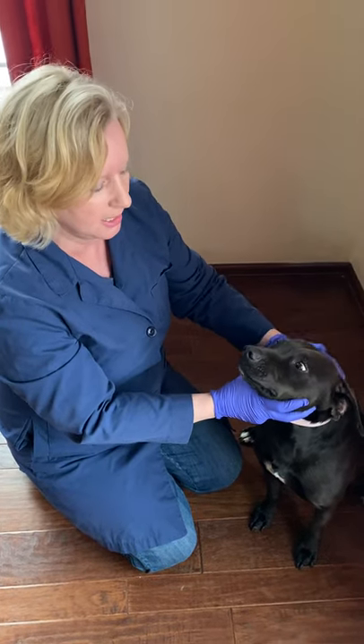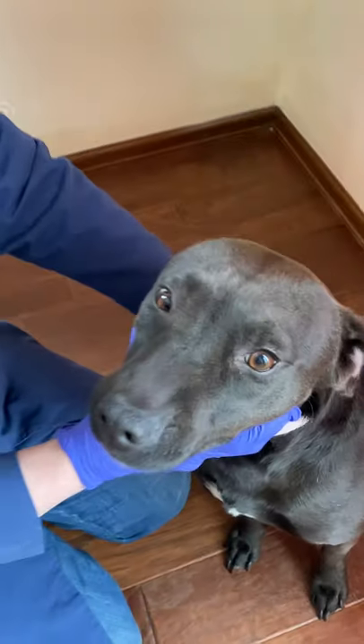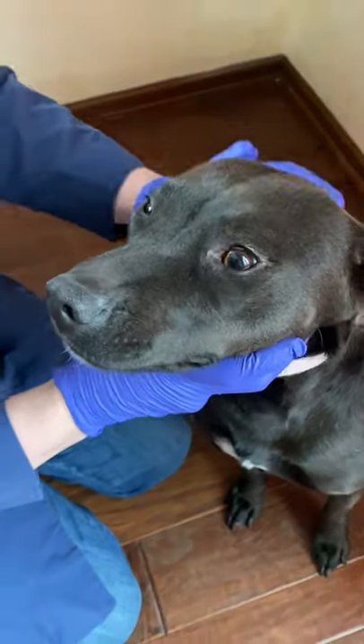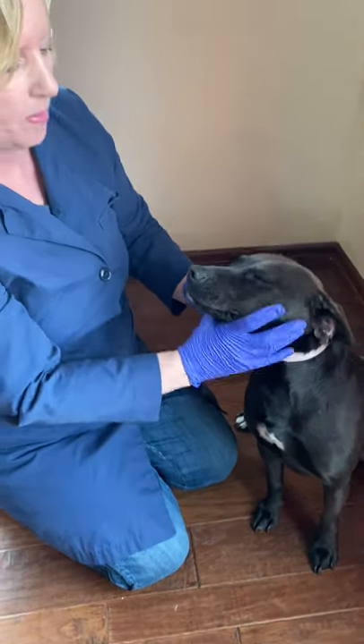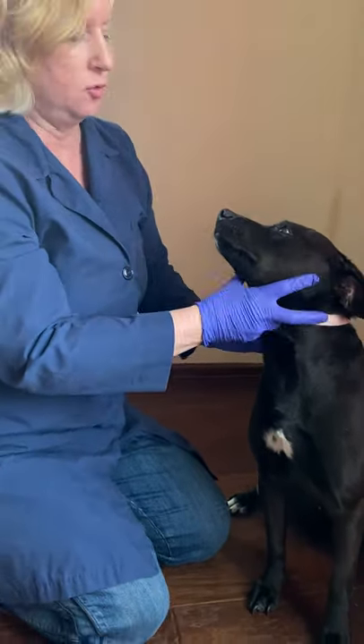Hi! I'm here today to demonstrate an oral exam on a dog. I'm going to start by introducing myself, saying hello to Kaz, and I'm going to start by looking over her head and face for symmetry.